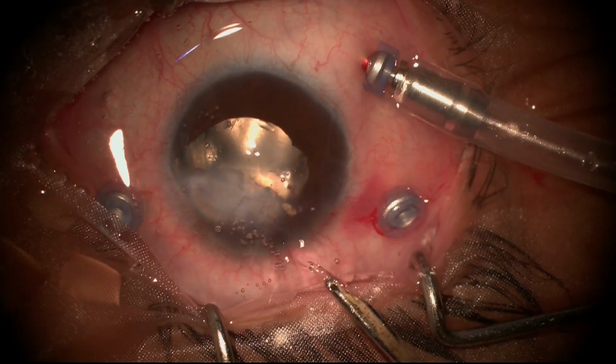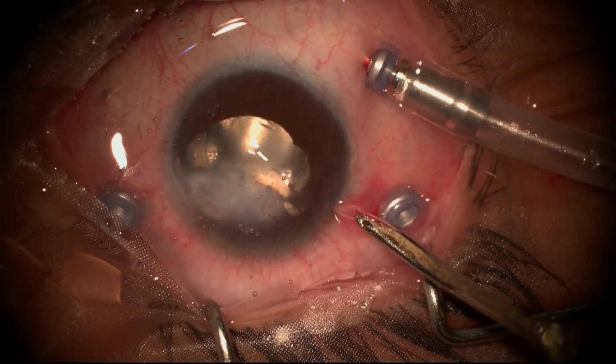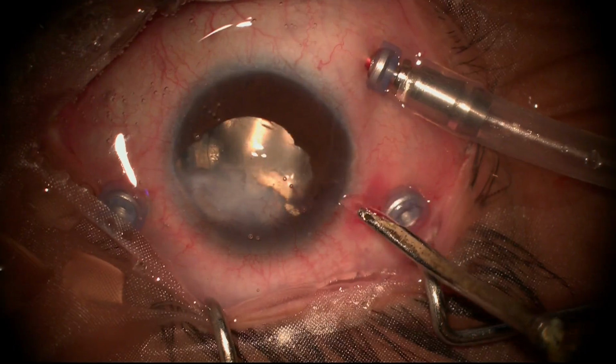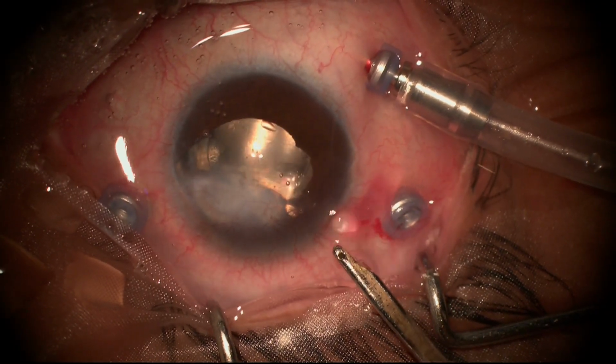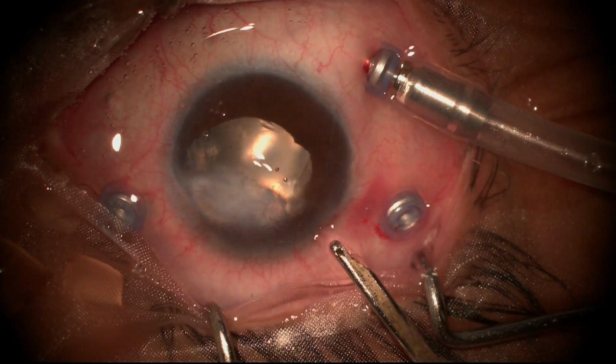Although we already had this incision which was opened up, just for a phaco, we could have just gone inside. I missed it. I didn't need to make this incision. And now that we have made it, let it remain sealed.